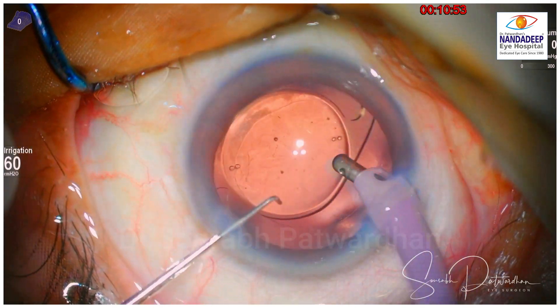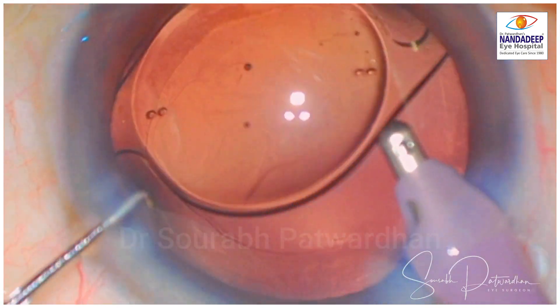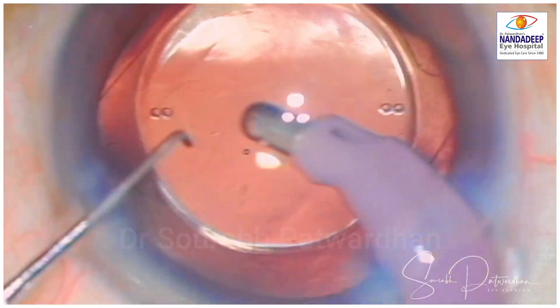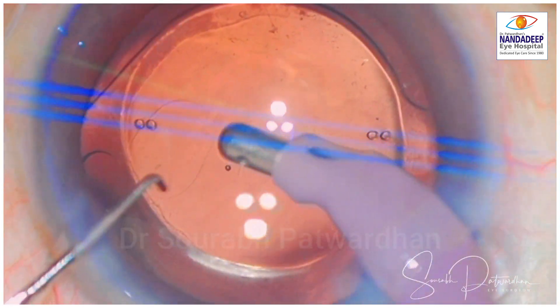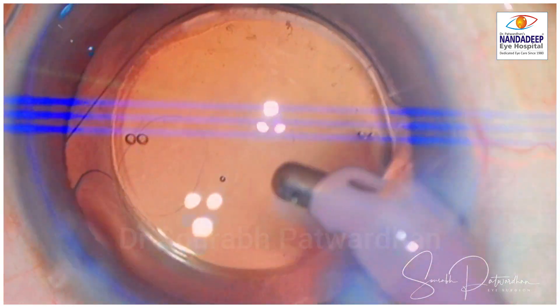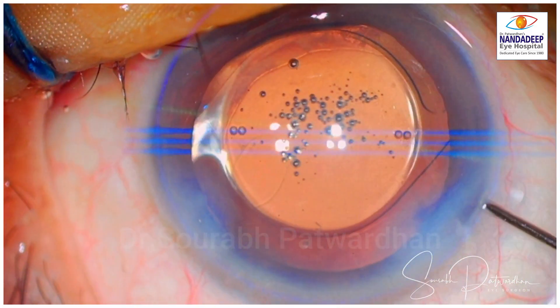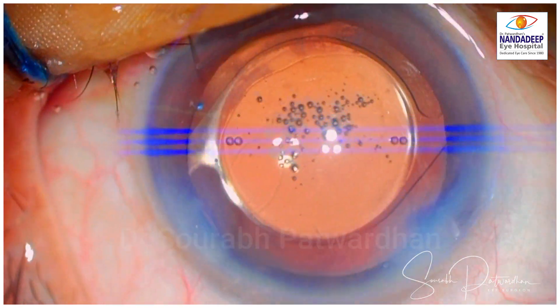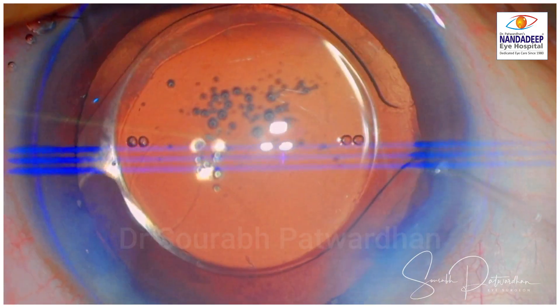Rotate it near the axis where you want to place it and then do viscoaspiration. You can see that I am using 60 cm of bottle height. I am going to aspirate all the viscoelastic, making sure that the aspiration port doesn't direct towards the anterior hyaloid area. I am going to gently nudge the IOL into the axis of placement. I am using the Callisto markerless system here which is guiding me for the IOL placement. Once it is done, just hydrate the incision and nudge the IOL into the final axis of placement. Even with posterior capsular rupture at the time of epinucleus emulsification, I proceed to PCCC and place the IOL in the bag.